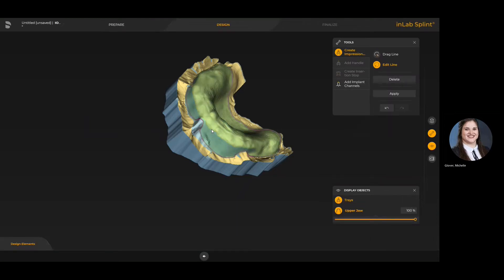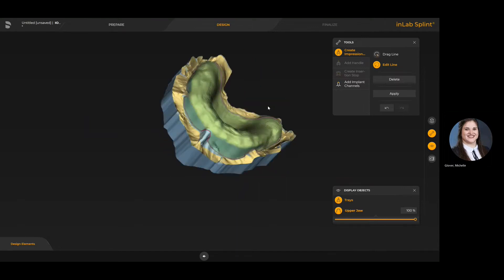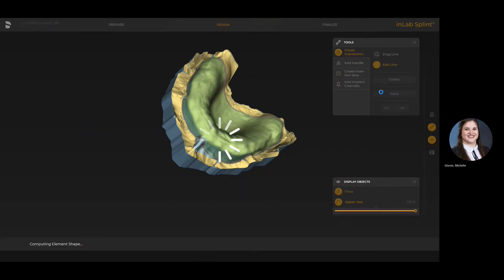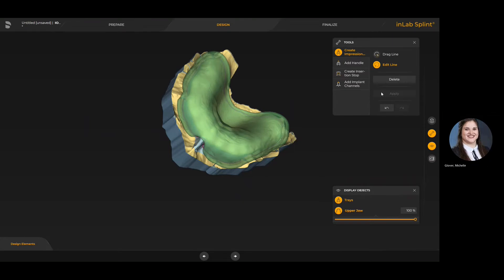Once you have defined the borders — when the tray is shown in that light green with the purple edge — you can still make adjustments by double clicking on the existing line and then double clicking to finish. What you want to do at this point is apply the parameters, applying the thickness and the lift, because otherwise it'll give you a flat paper-thin tray and it won't let you move forward. So always make sure you hit apply at this point.